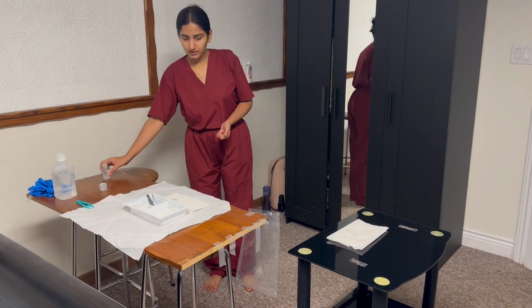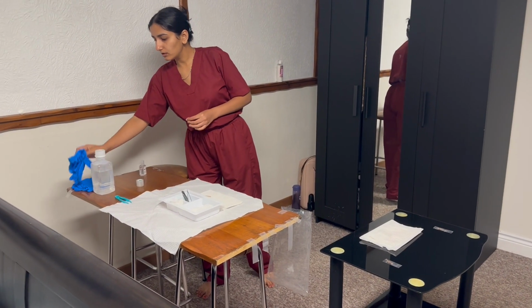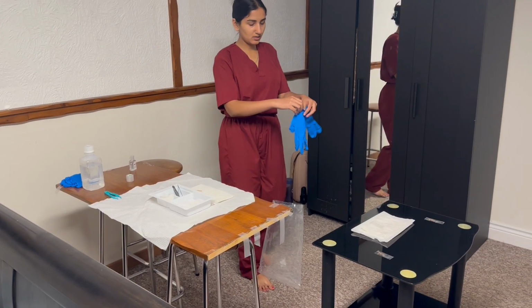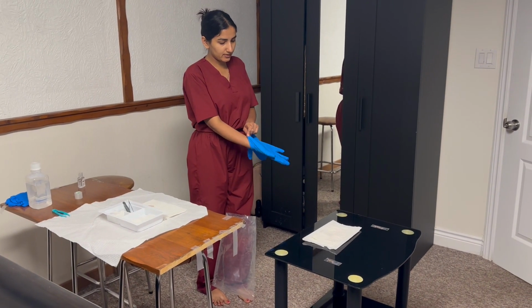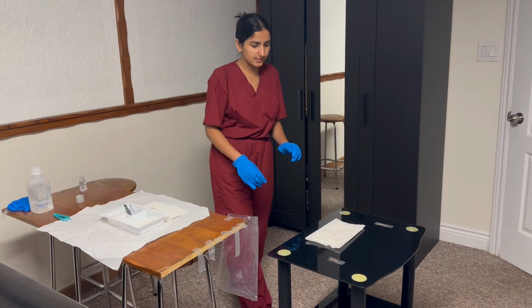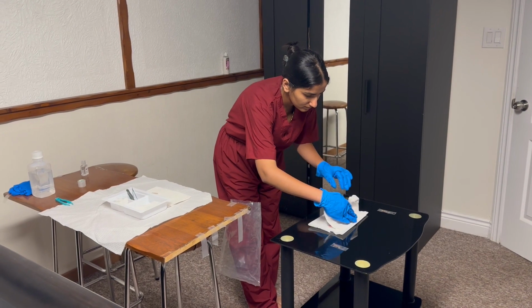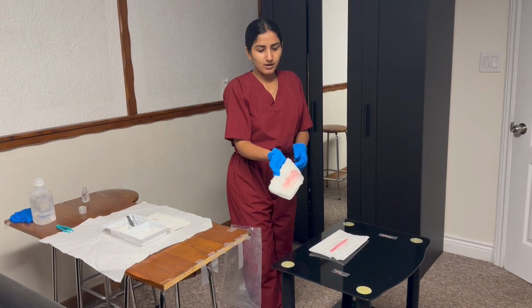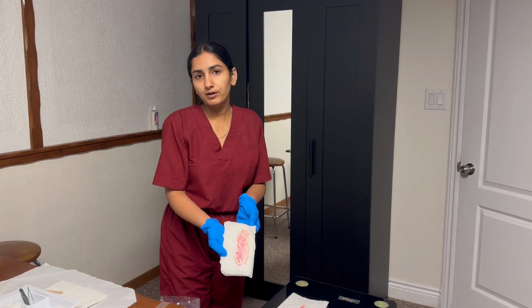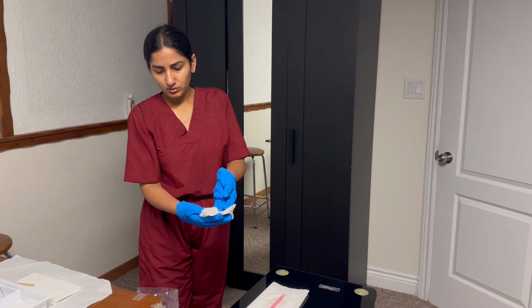Now I will ensure my hand hygiene. So to remove the dressing of the wound, I will put on the gloves, away from the tray not to break the sterility. And I will now remove the dressing. So as I can see the dressing, it is dry, there is no active bleeding and the fluid is serosanguineous and there is no pus and no odor. So I can now throw it after assessing.